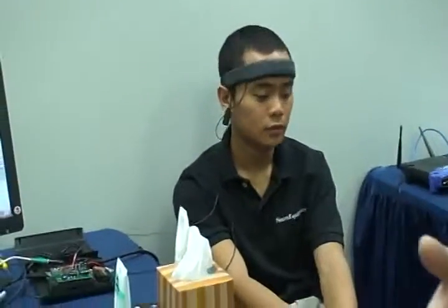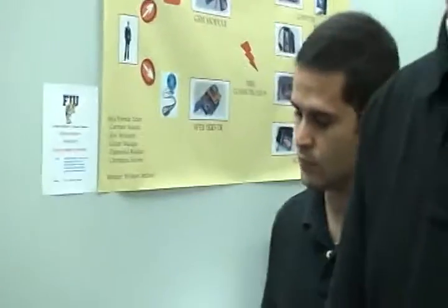So the main purpose of this, separate from being an open source kit, is for entertainment purposes. It could be hooked up to some kind of toy to control, for example, a ball floating on a fan, up and down based on your concentration, any type of device in that sense. But that's for our prototype. The medical applications for brain-computer interfaces are very, very huge and advancing by leaps and bounds.